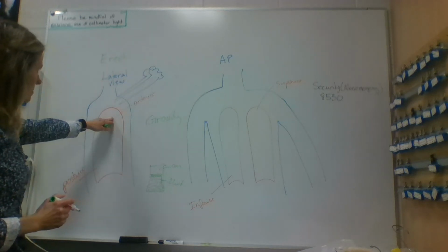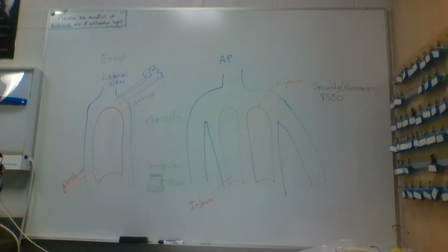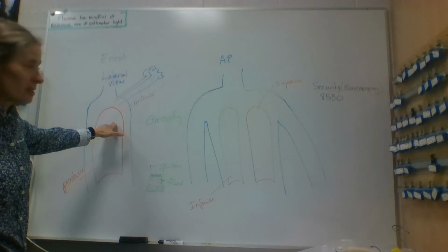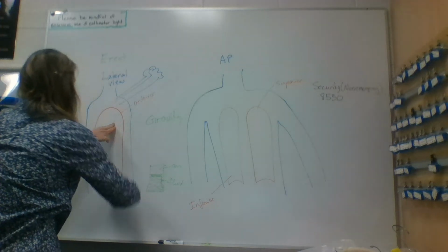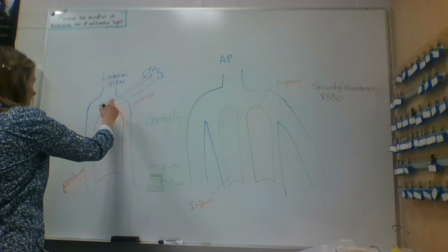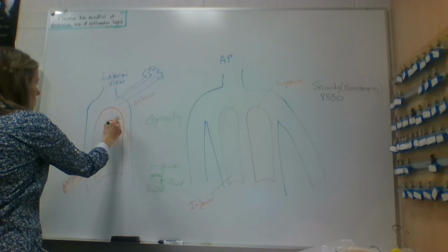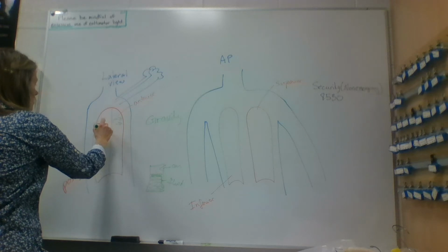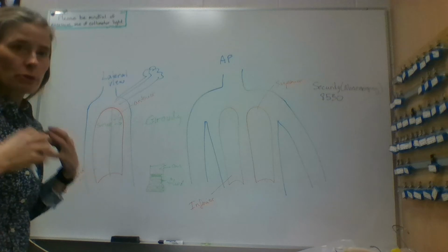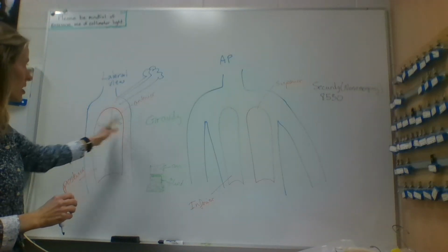So air rises. If we're looking to treat a pneumothorax, the chest tube is going to be inserted in the anterior part, because if the patient is supine, the air will rise. So the chest tube will be effective when they're lying supine because the air will rise.